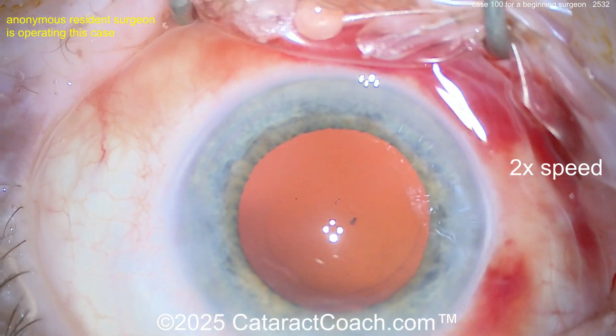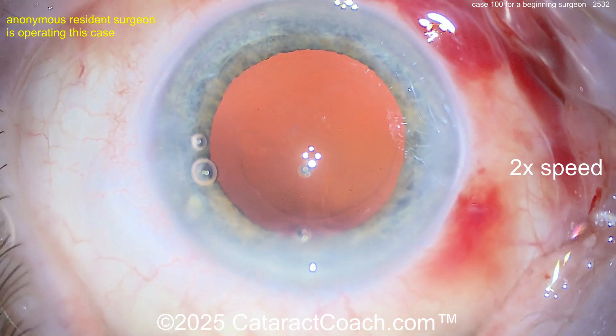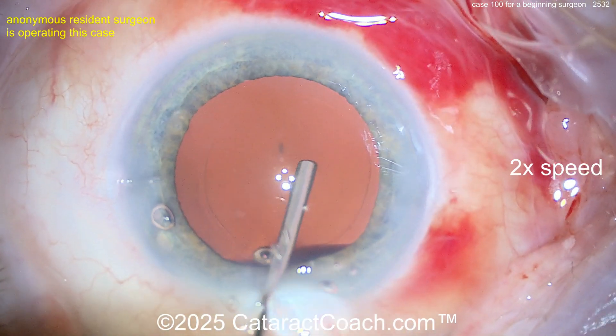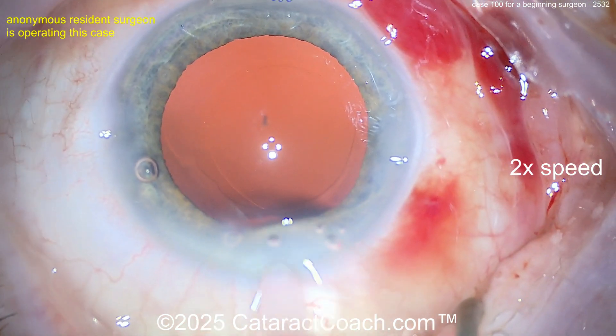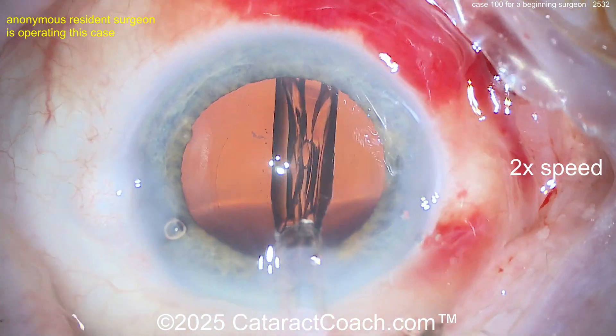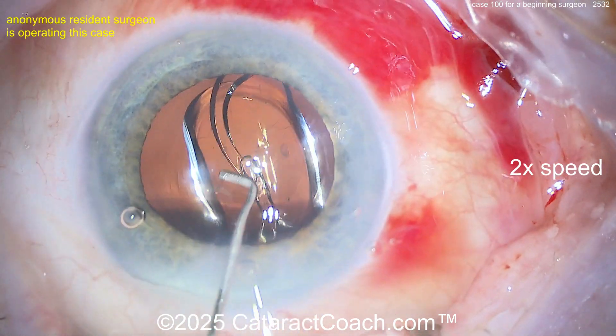I would tell you: fix your draping — there's a lot of gunky stuff and oil on the tear film, fix that before you start the case. Fix the incision — not a fan. The rhexis was good. Divide and conquer is good. I think you can start to advance to stop and chop. And there was chamber instability during nucleus removal, so you definitely need to adjust your phaco settings.